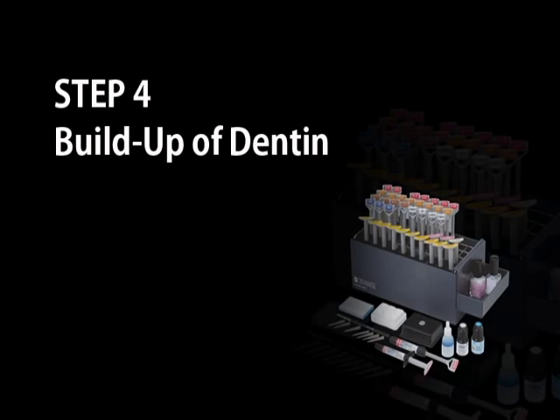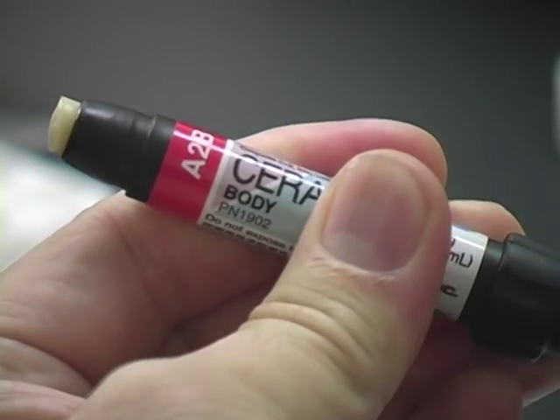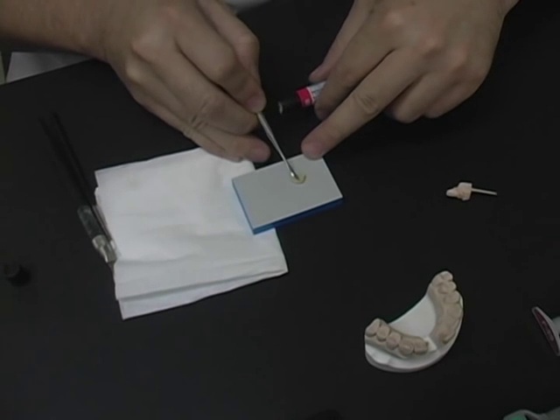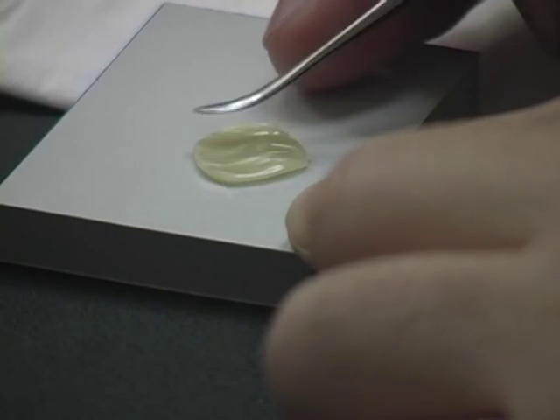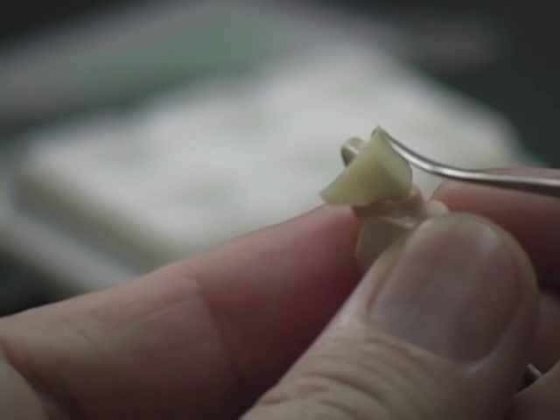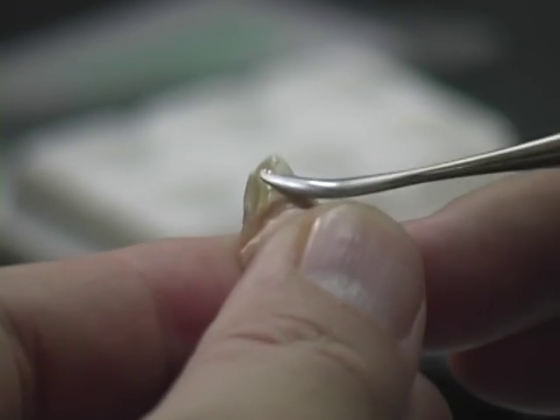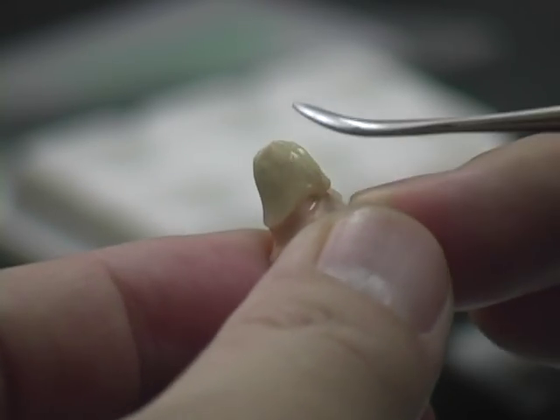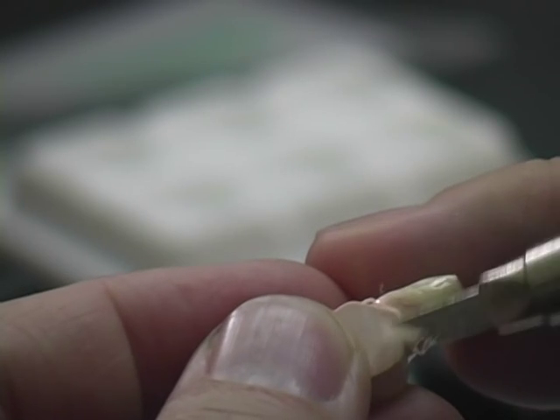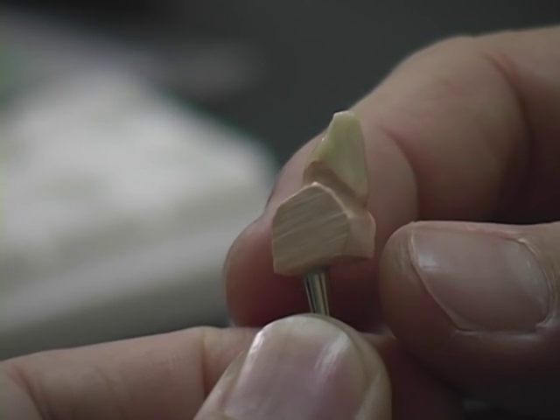Build-up of dentine. Select the shade of Ceramage body and dispense the required amount onto the paper pad. Press the material to a thin circle and take half to apply over the die. Gently adapt the material over the entire surface, ensuring no air bubbles are included. Ceramage is easy to handle and doesn't stick to the instrument. Remove the excess from the margin area using a cutting knife. The first application of dentine is complete.